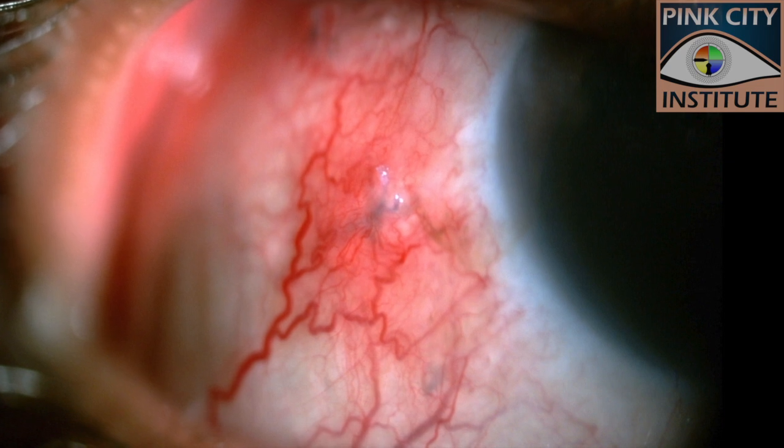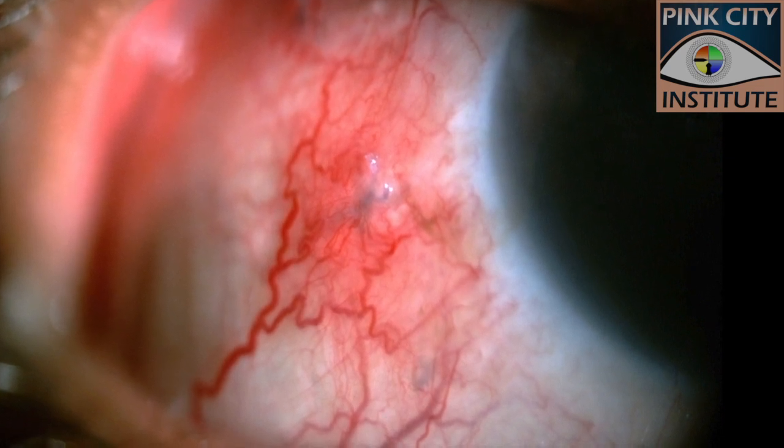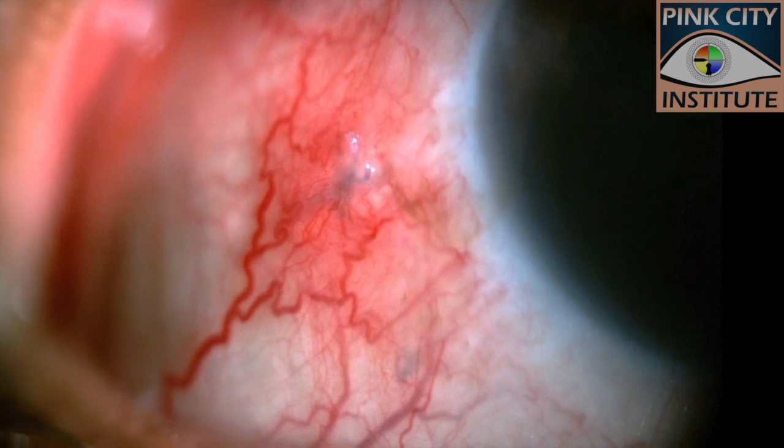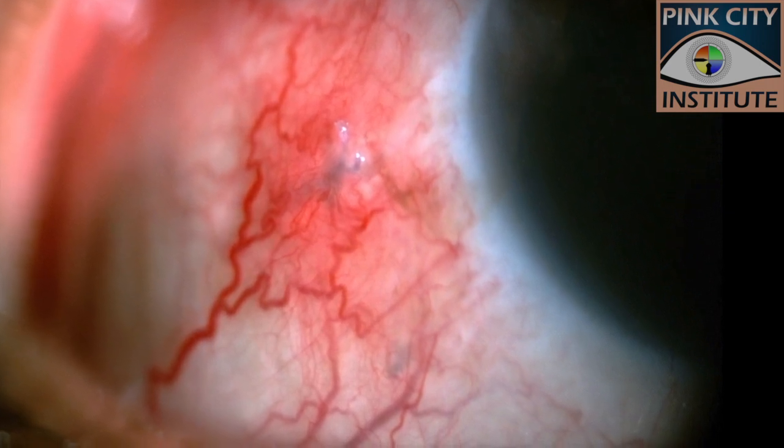We leave you with an interesting case. In this eye, the upper sclerotomy was tied conventionally while the lower was plugged with the polyglactin technique. The difference is for you to see.